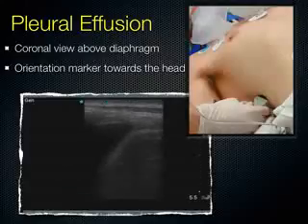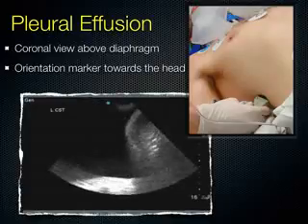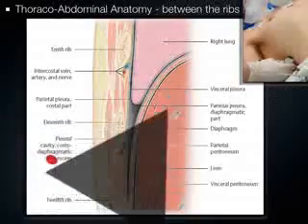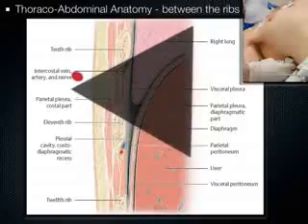This is the space, again, where you're placing your probe. You're finding the liver, you're moving up and down so you can find that person's diaphragm, and this area is where you want to image. People's diaphragms are in different places. People don't necessarily read the textbooks. COPDers have very low diaphragms because their lungs are hyperinflated. Some people have great big livers and their diaphragms are up in their armpits. So you need to look around and find out where the diaphragm is. Don't just assume.